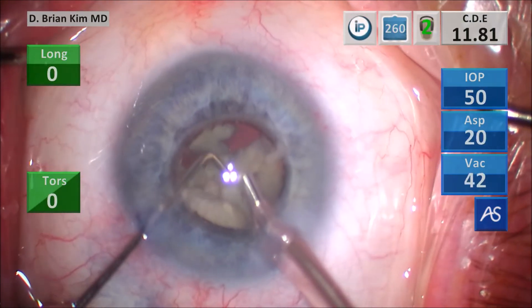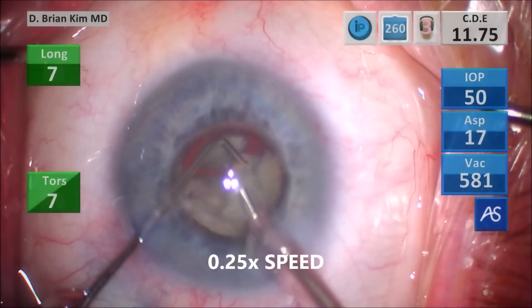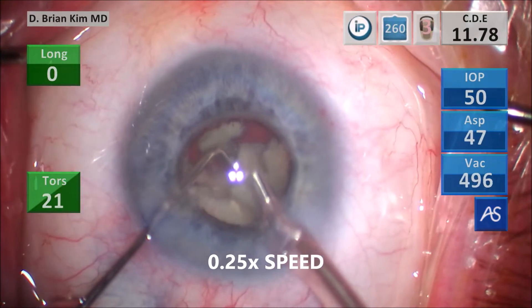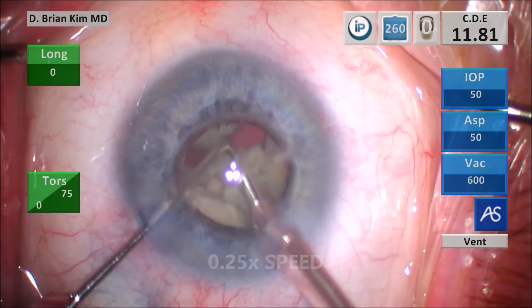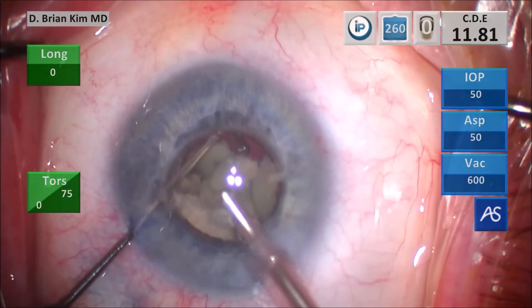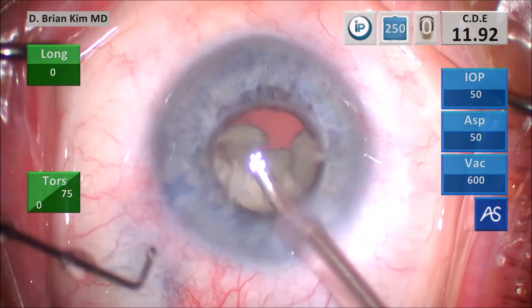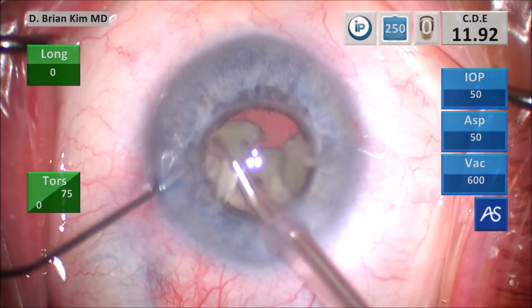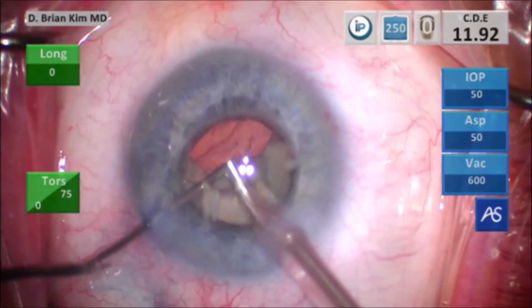Right here is when I notice something funny — see that lens fragment just underneath the chopper. Pay attention as I apply aspiration and vacuum. Look what happens to that piece: if I apply aspiration and vacuum that piece should come towards me, but instead it's going away. That's because there's a posterior capsule defect. I use the chopper to lift that piece up away from the defect, and then I realize I've got to stop. I stop and push viscoelastic into the bag, but first I tease that lens piece up away from the defect.